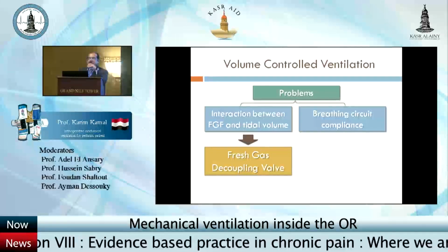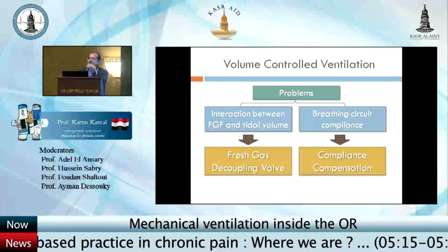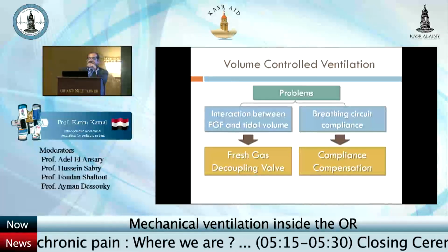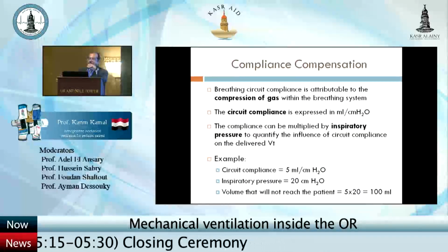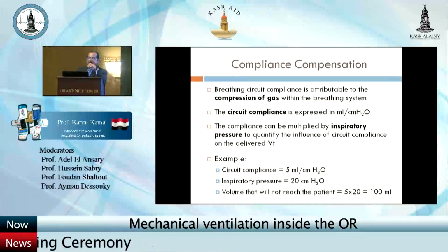What about the breathing circuit compliance? The answer for this one was what is known as compliance compensation. What is compliance compensation? As you know, breathing circuit compliance, like we just said, is attributable to the compression of gas within the breathing system.